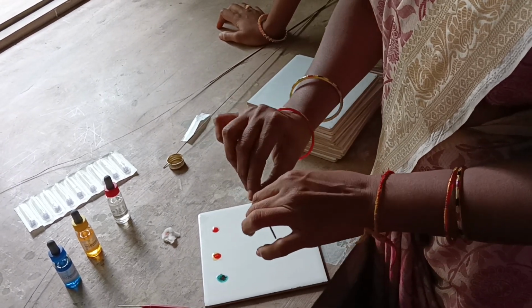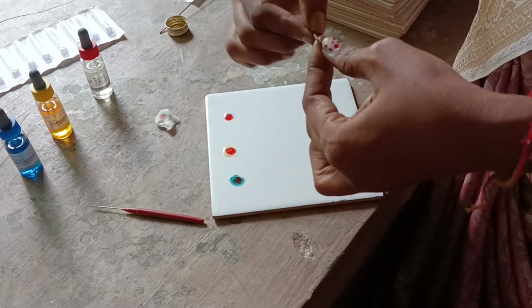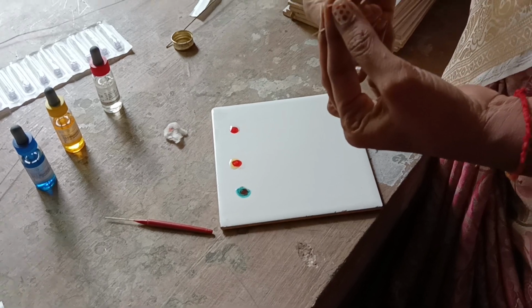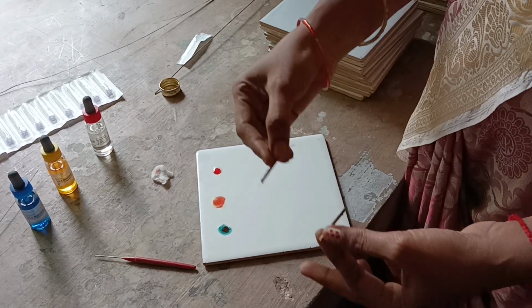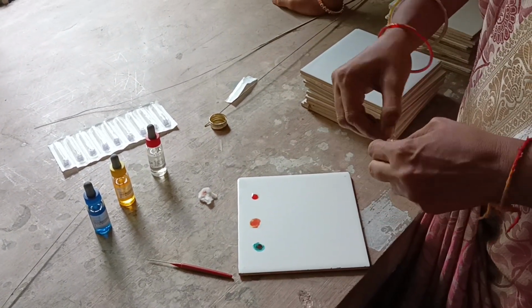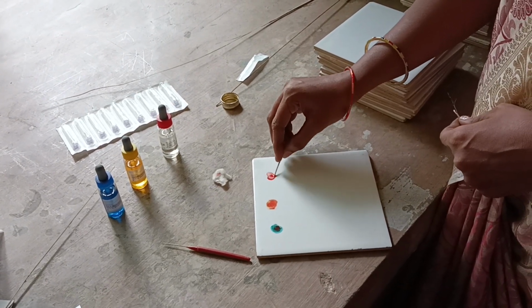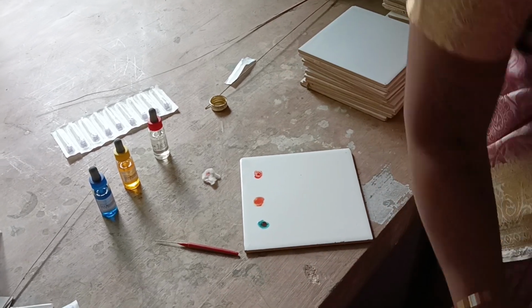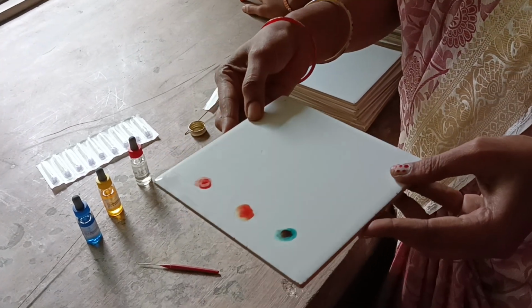We should not use the same one for mixing. Now see, you have to wait for 5 minutes.